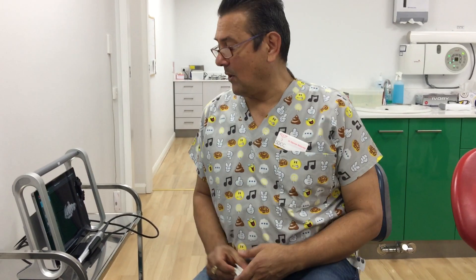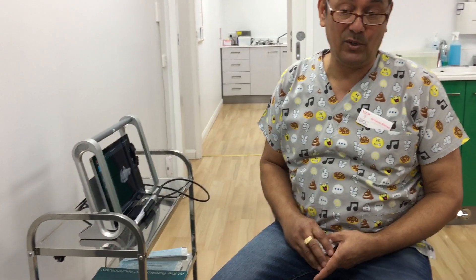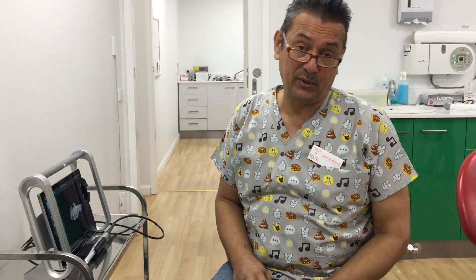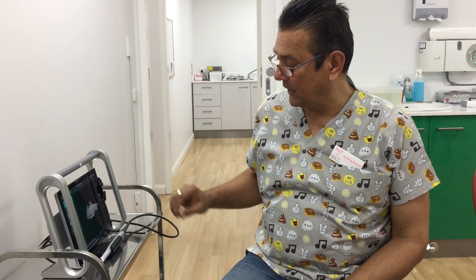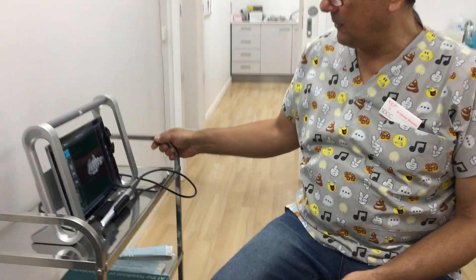Hi, Denver from Mullaney Dental and Cosmetic. This is our new scanner that we use for crown and bridge and for orthodontic clear aligner technology. It's a 3M True Definition Scanner if you want to have a look at it.